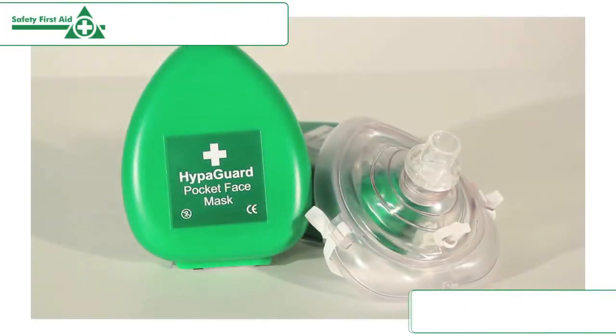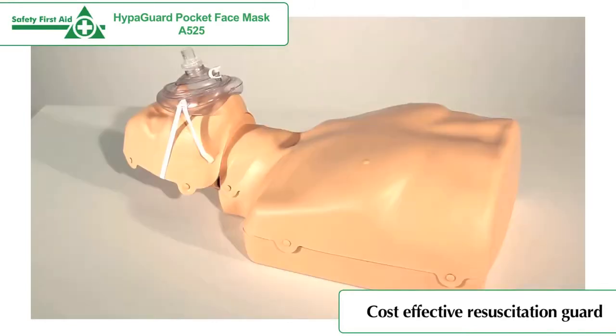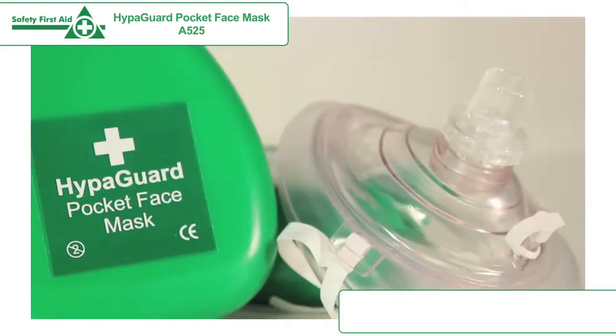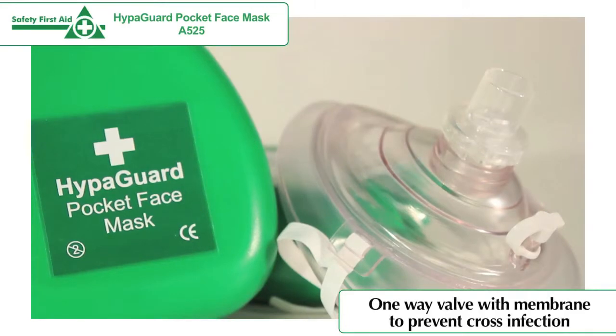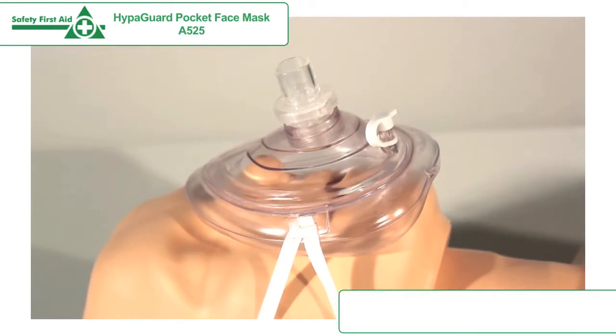The HyperGuard Pocket Face Mask has been designed to provide protection for the rescuer and the victim when manual resuscitation is being performed. The face mask has a one-way valve with membrane to prevent cross-infection. The transparent dome allows the rescuer to visually check the patient's lip colour and to check for vomit.